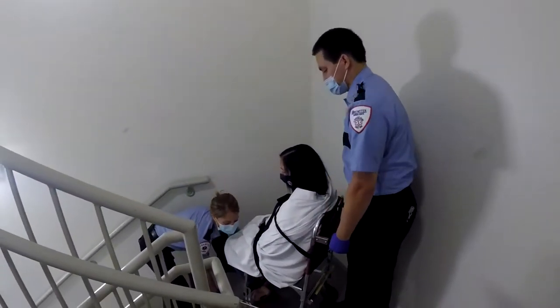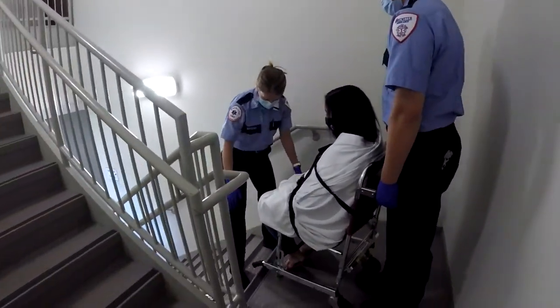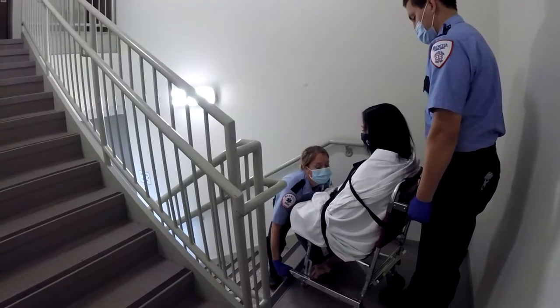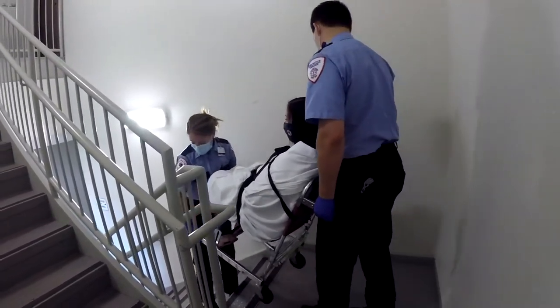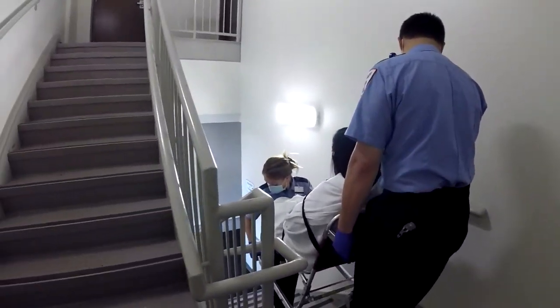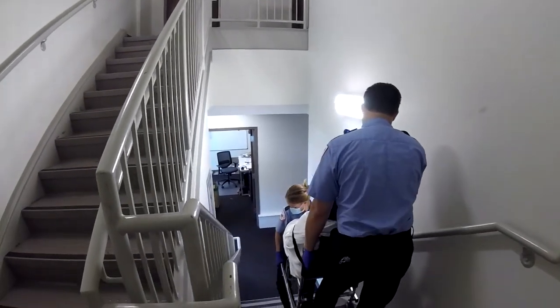Whether you are at the head or the foot of the stair chair, it is always important to use proper lifting techniques, communicate extensively with your partner, and ensure you have proper footing as you go down each step. Take your time, remain calm, and reassure your patient throughout the entire process.